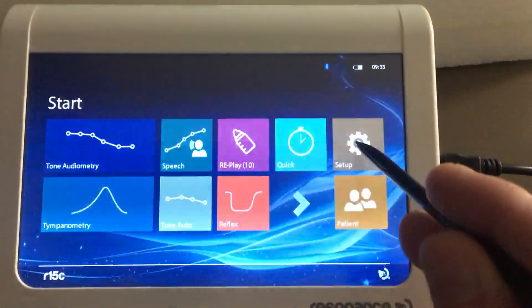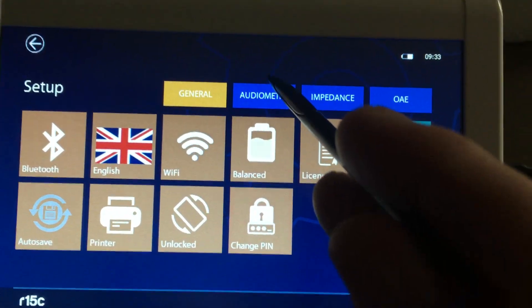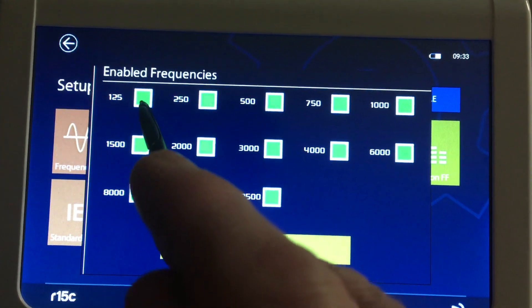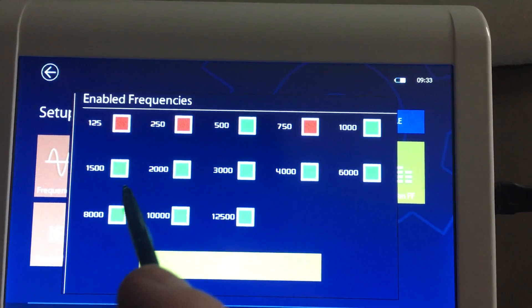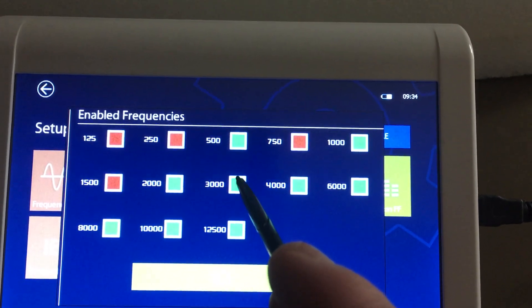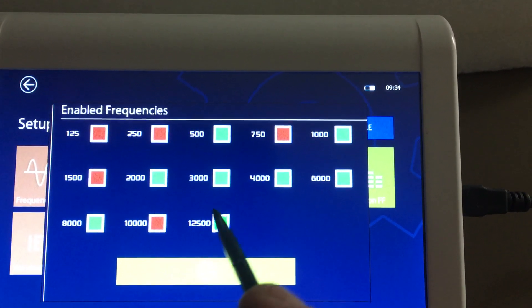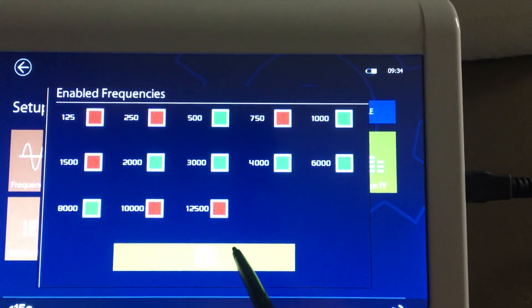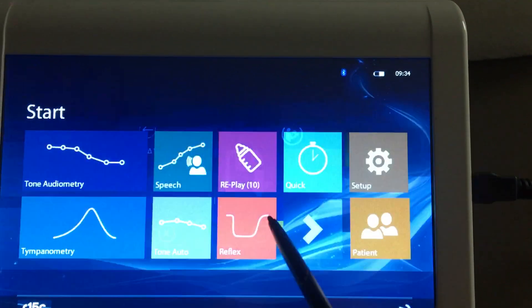Right now we're going to go in and look at the settings for the audiometry. It will tell you which frequencies you want to use — you can test all of these. We are going to test 500, 1,000, 2,000, 3,000, 4,000, 6,000, and 8,000. Once we turn off the ones we don't want, press OK. We'll press back, it'll ask us to save, and we're going to say yes.